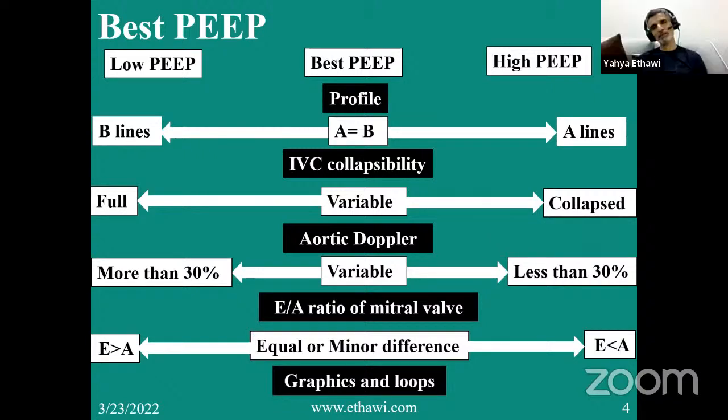Oh, that's a different topic. This is hemodynamics. We're talking about best PEEP. We can talk about the E/A ratio for one hour, but others will not understand, so that's a different topic. But the E and A ratio can be helpful in deciding the best PEEP.